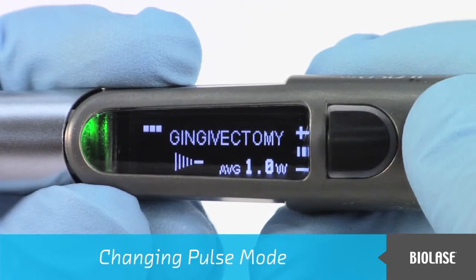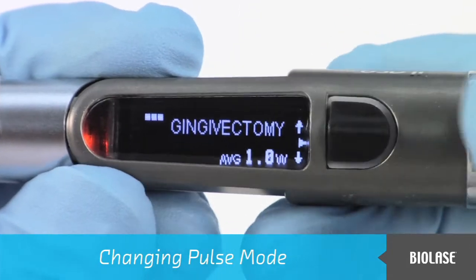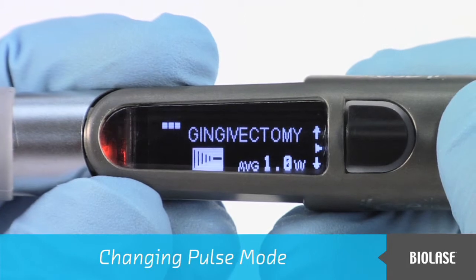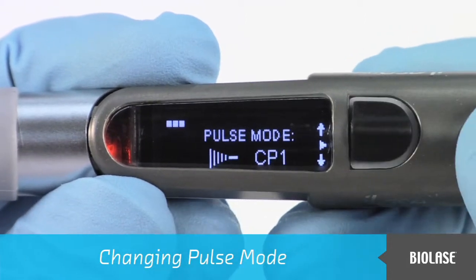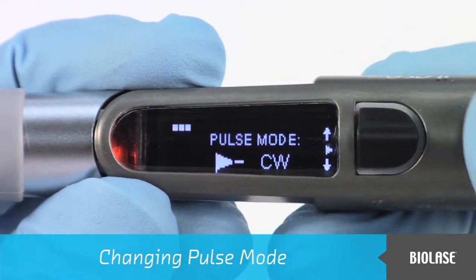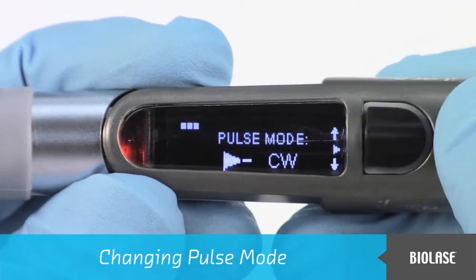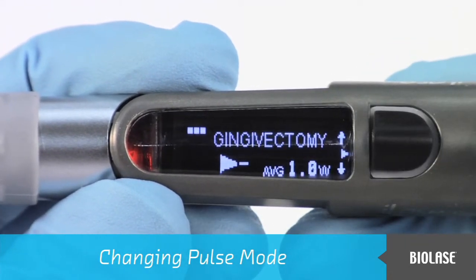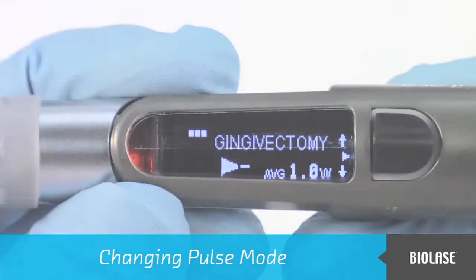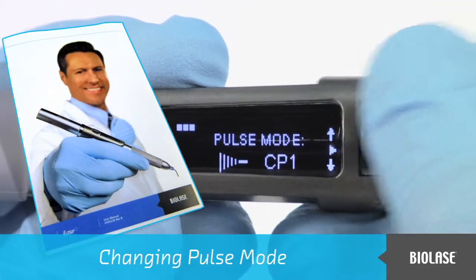To change pulse mode, first enter standby mode. Then push the black navigation button up or down until the pulse mode icon is highlighted. Then press the navigation button in. The pulse mode screen appears, and pushing the navigation button up or down will present the 3 different pulse modes. Press the navigation button in to make your choice. To continue with laser activation, be sure to place the iLase into ready mode. For more information about the different pulse modes, please refer to your user manual.